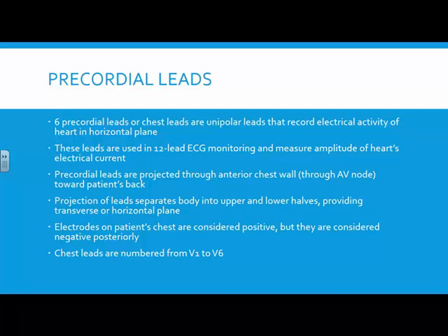Alright, so when we talk about leads, the sticky dots are called sticky dots, and our picture or our view is called leads. So let's refer to the dots as sticky dots, and we'll refer to leads as leads, with what we're looking at, okay? If I say I'm looking at the leads, I'm not looking at the sticky dots. If I say I need you to put the sticky dots on, that means I need you to put those on. Got it. Cool. For now, don't say sticky dots out in the hospital.